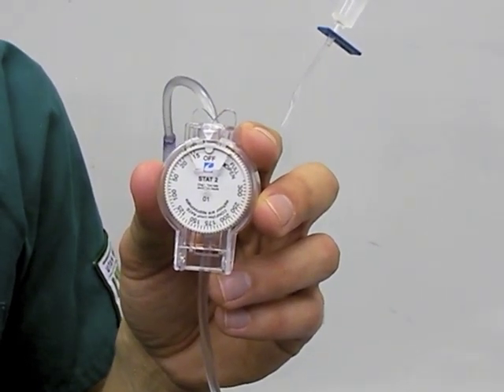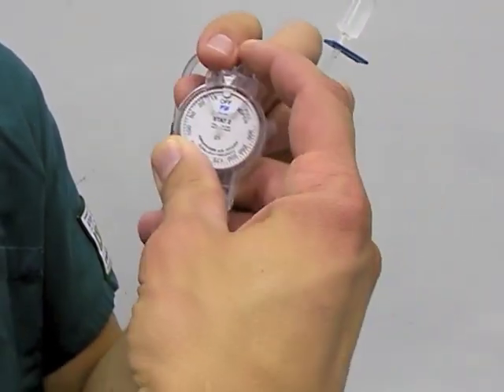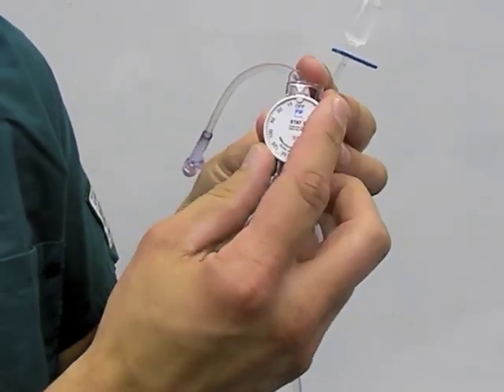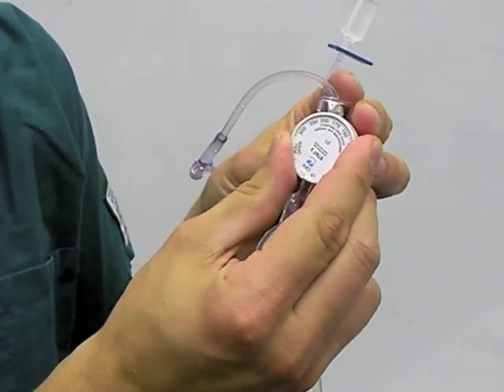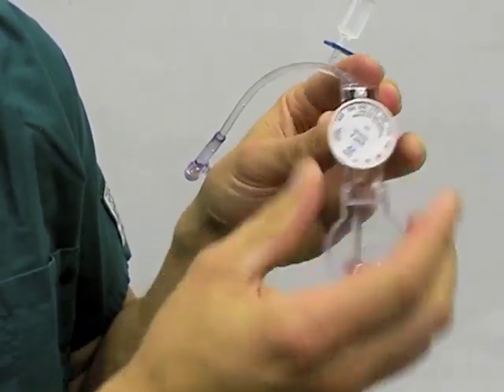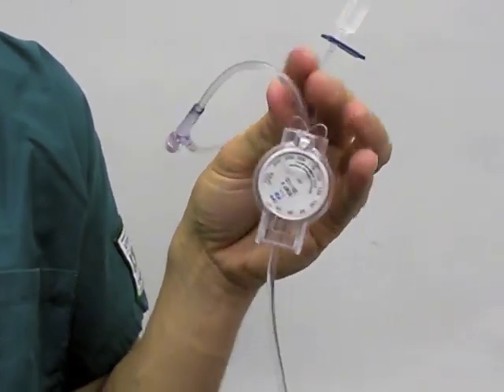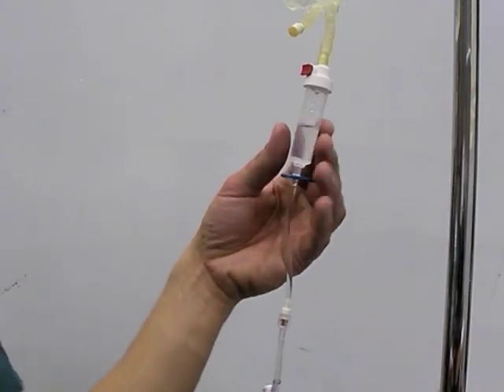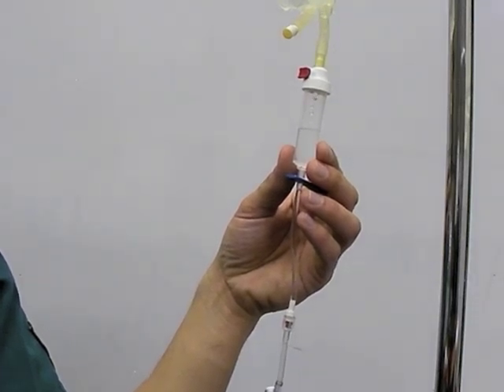Since we are using a dial-of-flow on this administration set, we can set our drip rate at the ordered 200 milliliters per hour by simply turning the dial to 200. After setting the drip rate, we still manually check the rate by counting the drips in the drip chamber, which we have calculated to be 50 drops per minute.